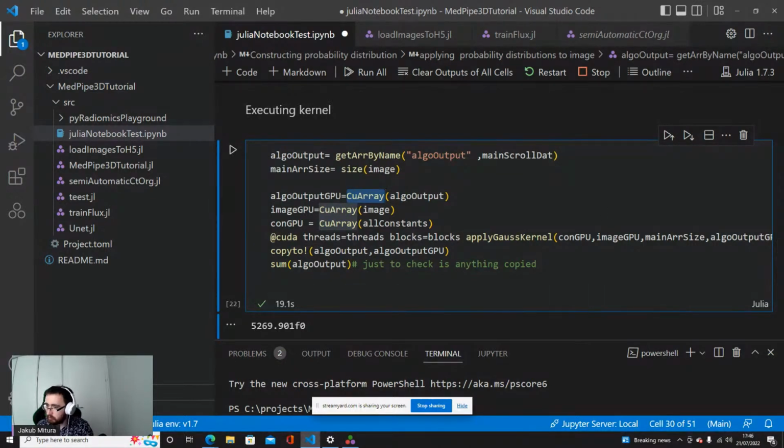Okay. Did one GPU allow you to store all the image data into global memory? Yes. In this particular case, yes. The data is a couple hundred megabytes for the image. I chose a not too big image, basically. And this algorithm is quite lightweight, so this algorithm does not pose big problems with this.